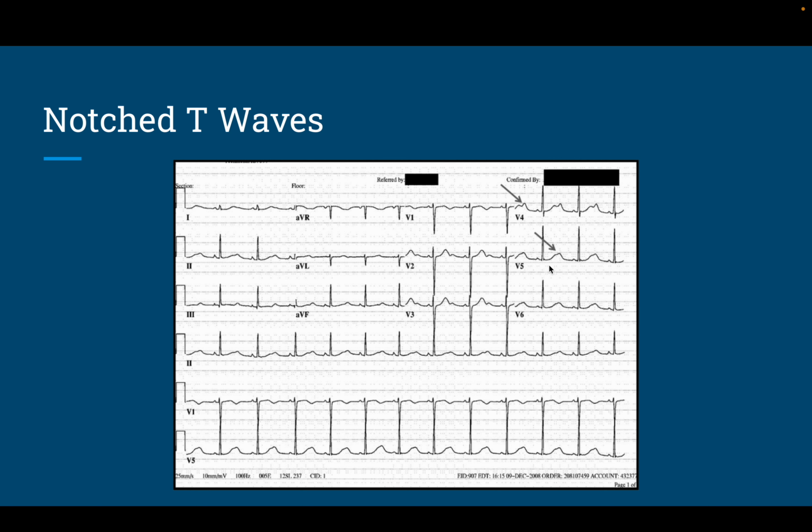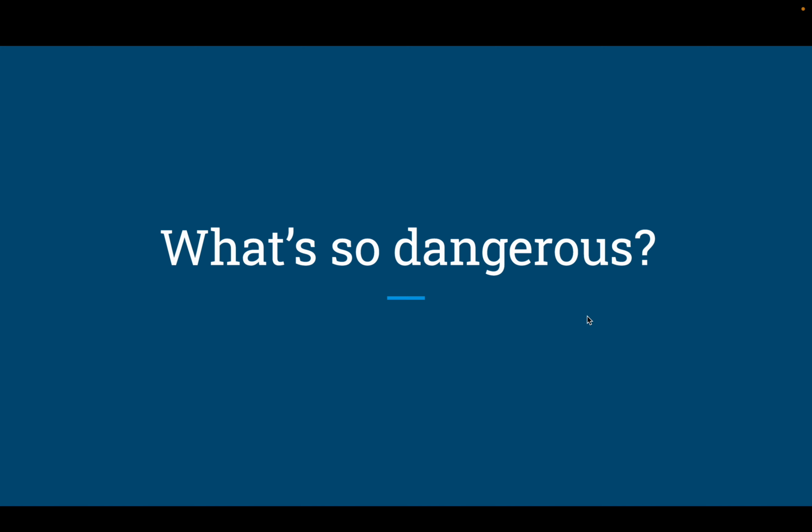You need to see this in 3 leads, according to the criteria, for it to be significant. But if you see this on a 12 lead, it's just something to look out for. So you don't see this really globally. You can see it kind of here in 2, definitely in V4, but those are just 2 different morphologies.